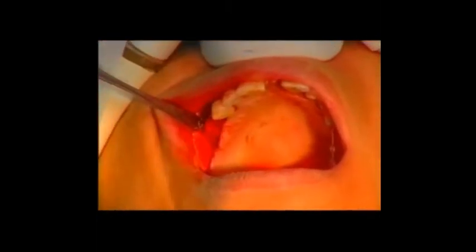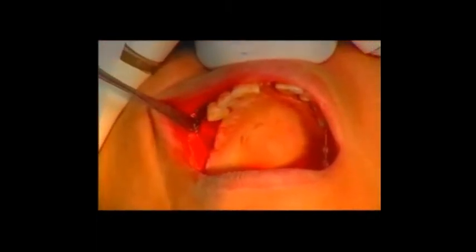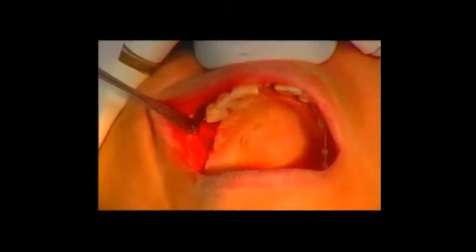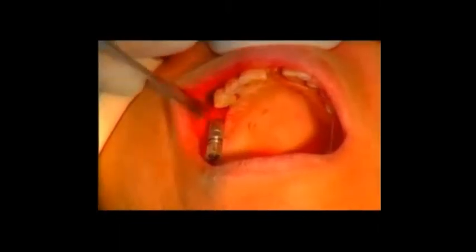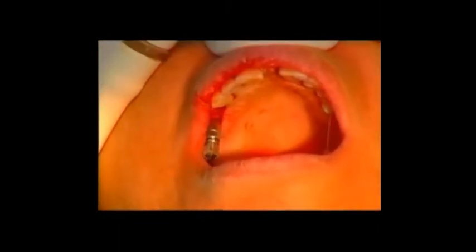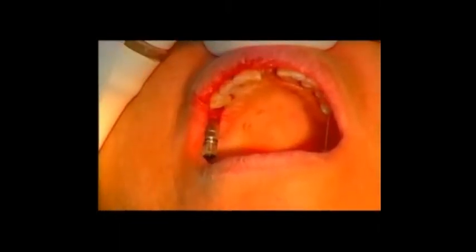Bone substitute is injected again into the osteotomy and the screw tap is advanced into the osteotomy. A periapical radiograph is obtained to confirm the penetration of the screw tap into the sinus.